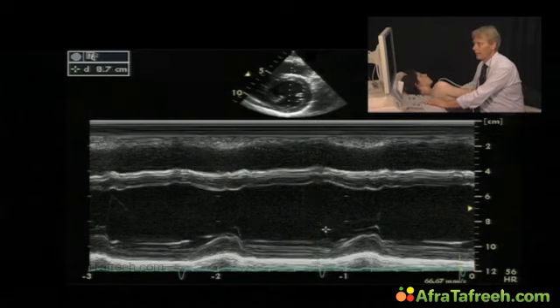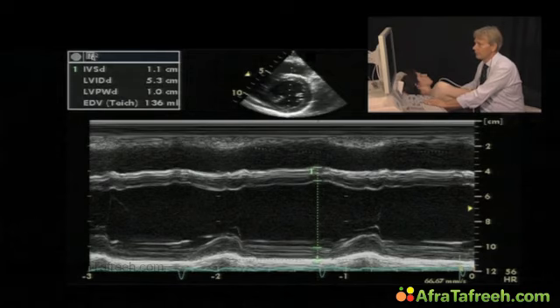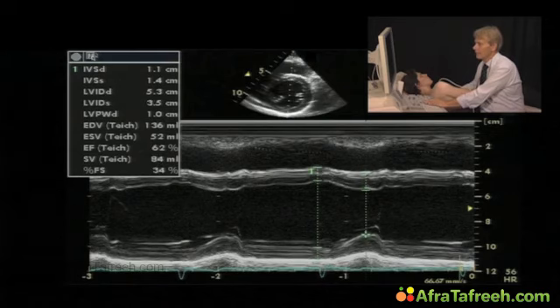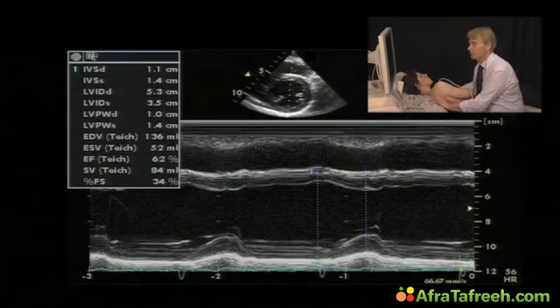So we have the biggest width of the left ventricle shortly before the QRS complex starts. So this is where you would start with your M mode measurement of the septum. Then you would measure the end diastolic diameter, the posterior wall. Now all these measurements are diastole, and you would then perform the same measurements at systole for the end systolic diameter, for the posterior lateral wall, and these are the measurements basically that you would perform.